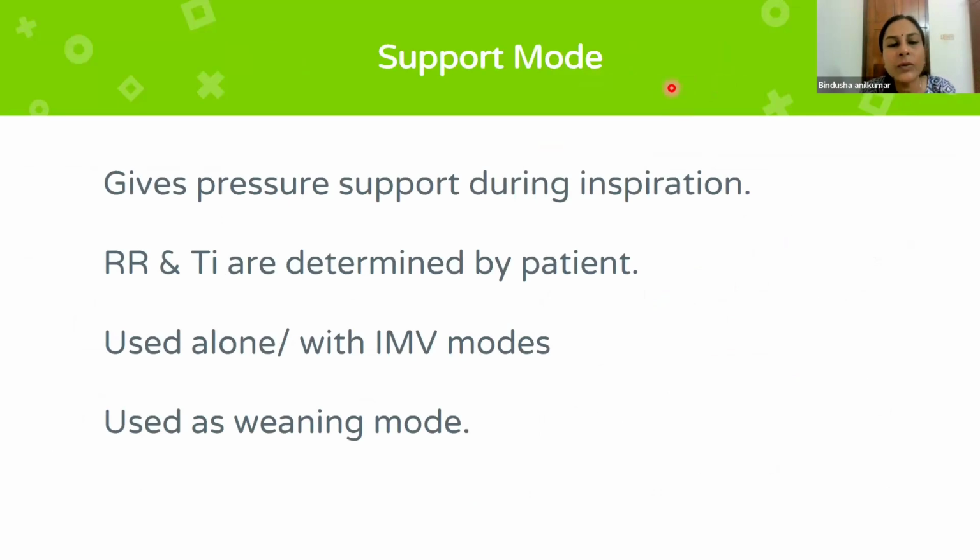Here the ventilator just gives a pressure support during inspiration. The ventilator will not interfere with the respiratory rate or inspiratory time. The respiratory rate and inspiratory time are determined by the patient alone. The patient will determine when to breathe, and also how long to breathe. The ventilator will only support the breath by giving a pressure support, so that the patient will be getting a better tidal volume.